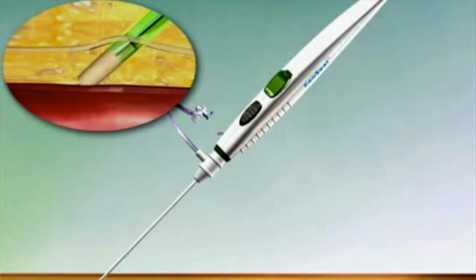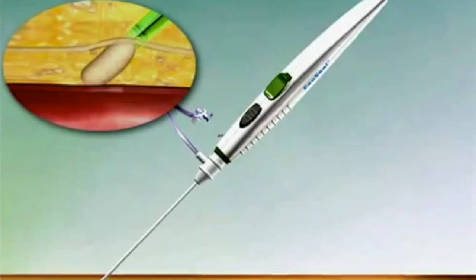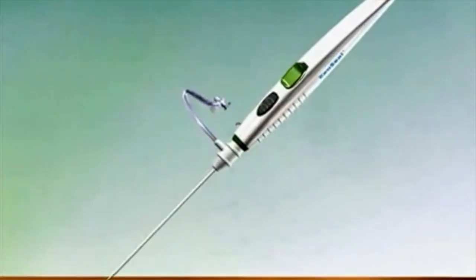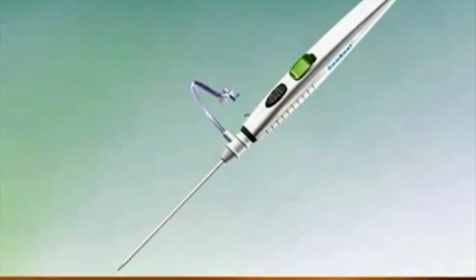Retract the ExoSeal vascular closure device and the vascular sheath until the device is completely removed from the patient and apply light pressure to the wound site for two minutes. Evaluate for hemostasis and apply a light pressure dressing to the puncture site.